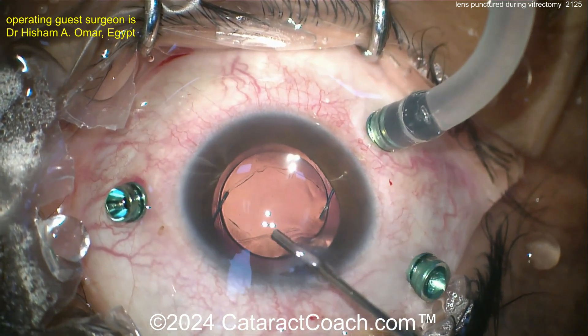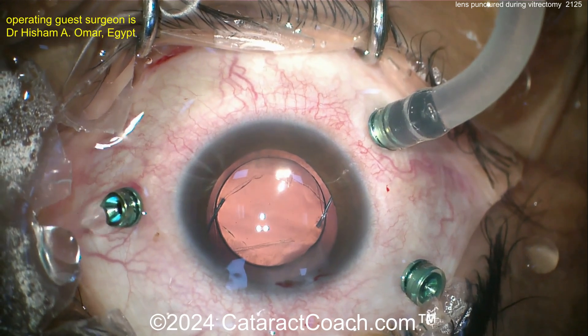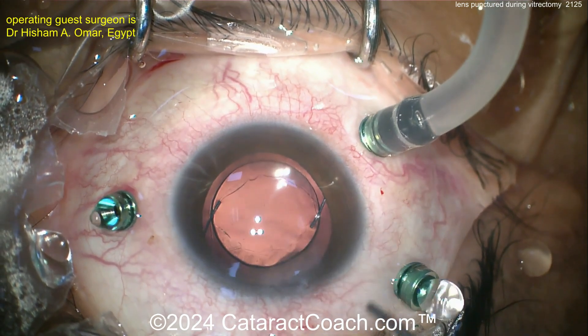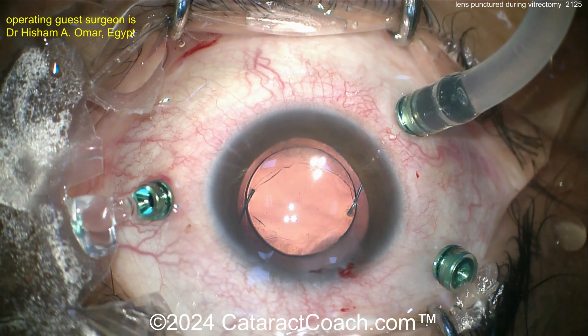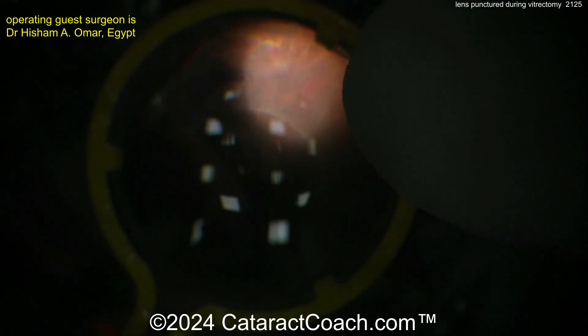This is going to be a nice happy patient. I like the choice of a monofocal lens — three-piece, obviously, for the sulcus. Getting the incisions sealed up. The patient was an emmetrope in the other eye; let's say age 50 or more. Targeting emmetropia or plano would be a good refractive outcome, because with the other eye also presbyopic, the patient still probably needs glasses for near work.